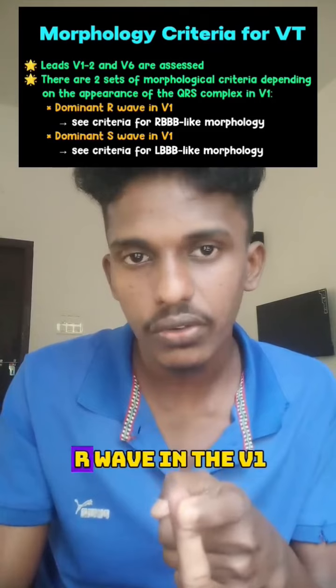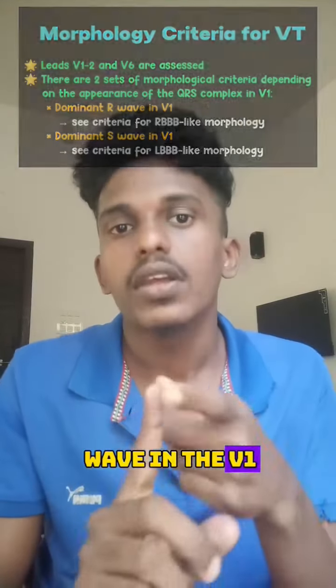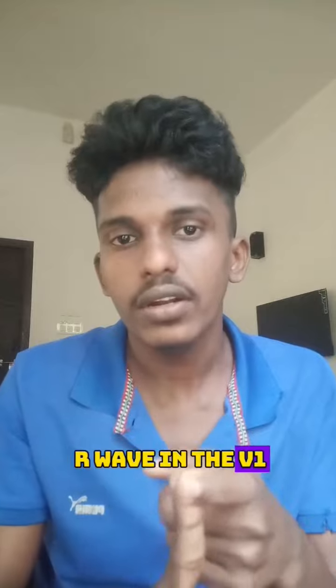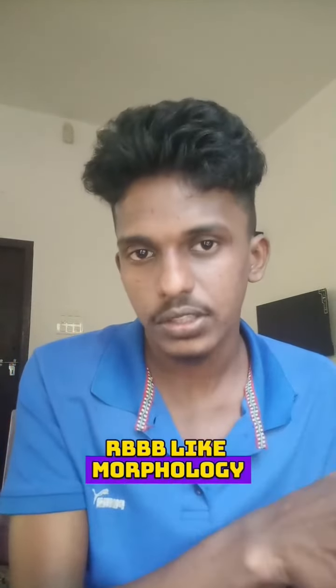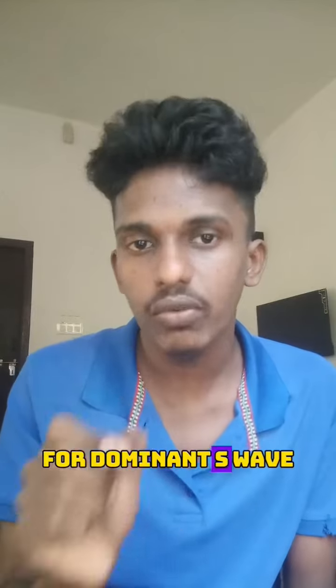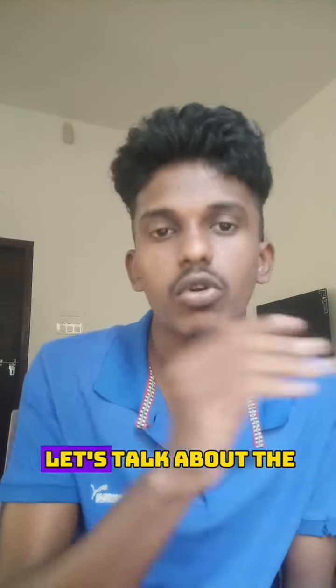One is the dominant R wave in V1 and the second one is the dominant S wave in V1. If you find a dominant R wave in V1, then you have to look for the criteria for RBBB like morphology. For a dominant S wave in V1, you have to look for the criteria for LBBB like morphology. Let's talk about the first one.